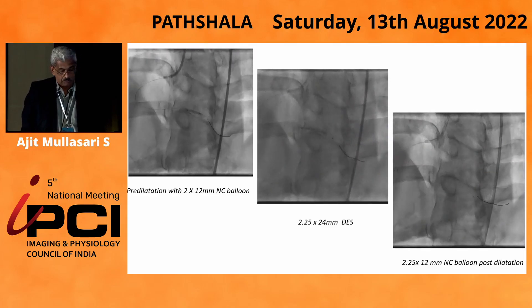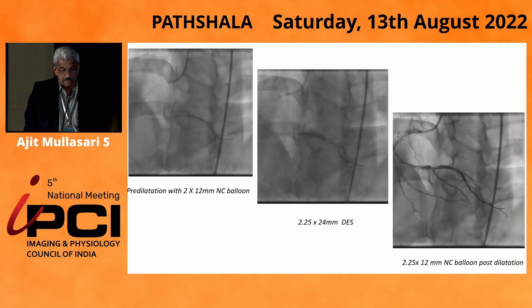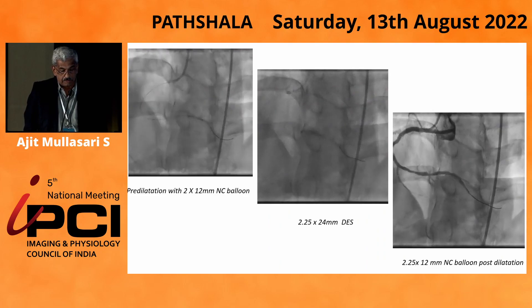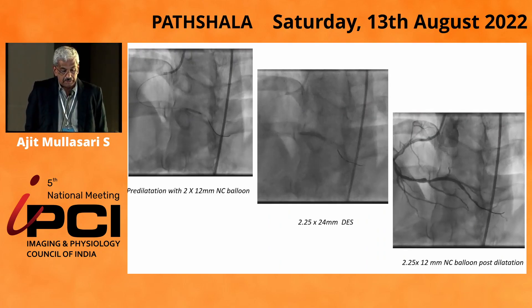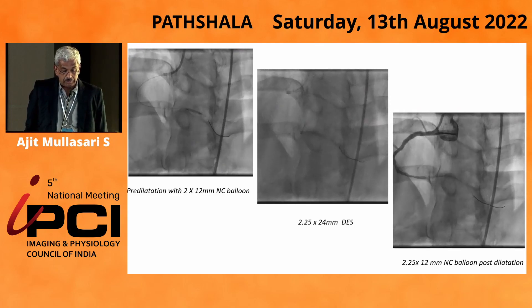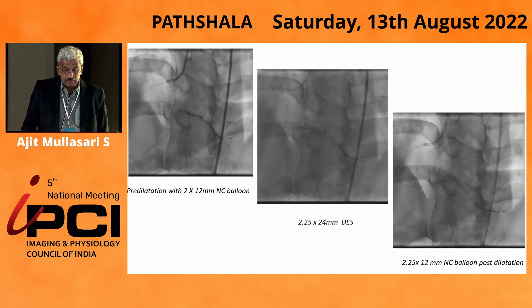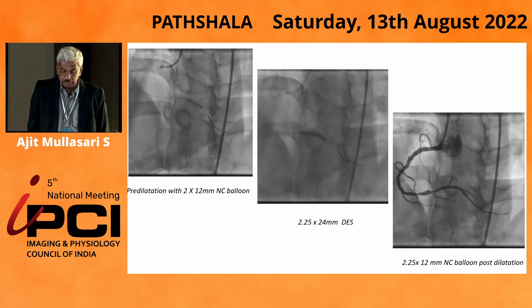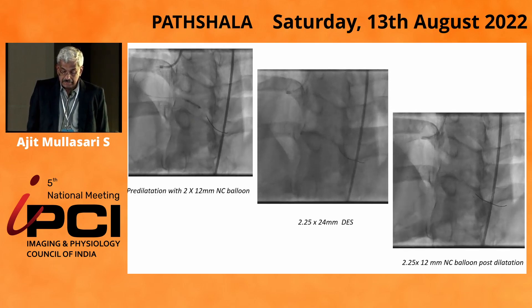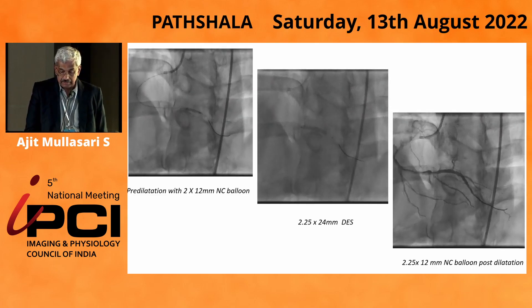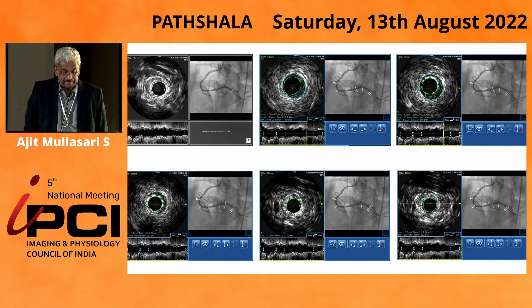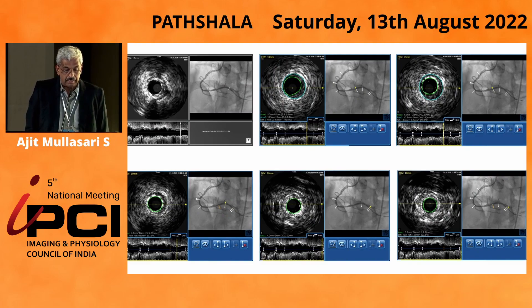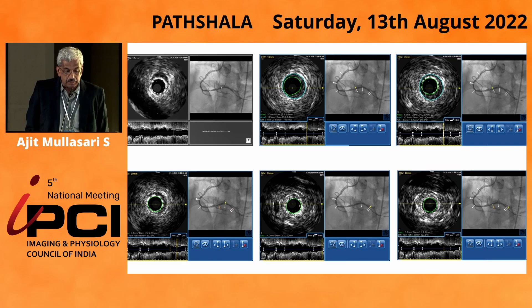We had measured 23 millimeters of length on the lesion. We pre-dilate with a 2x12 NC balloon, deploy a 2.25x24 DES, and post-dilate. Then we pull back to check on the IVUS first as to what we've done with the angioplasty.